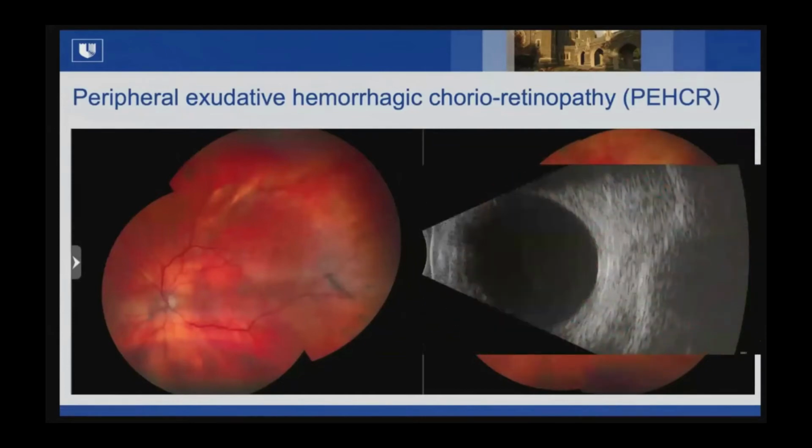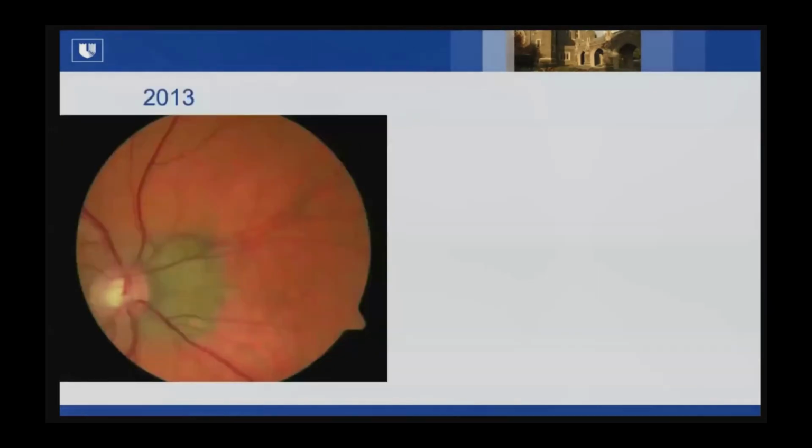This is the ultrasound showing how the PED was not present anymore. Again, we didn't do any treatment on this patient. Patient was happy for not having a tumor.